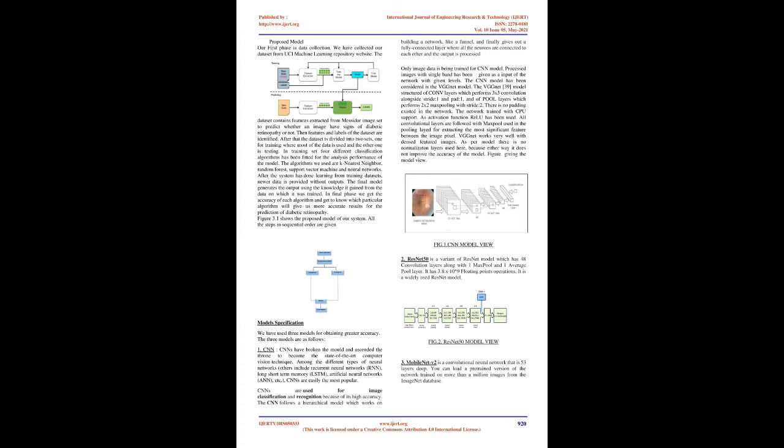Rakshitha et al.'s work throws light on the use of new imaging transformation methods for the enhancement of retinal images, like contourlet transform, curvelet transform, and wavelet transform. Their paper thus draws a comparison among these 3 imaging transformations. Verma et al.'s research studies discriminate texture features which are obtained by the color multiscale uniform LBPs, local binary patterns, that are descriptors on the 2 proposed hybrid and the 5 common color spaces. Then the extracted features are evaluated by enhanced EFM, a Fisher linear discriminant.